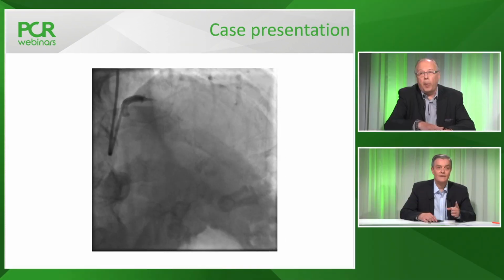Yeah, it's actually a question coming from the audience whether angulation of the side branch decides choice of culotte into true bifurcation with a planned two-stent strategy. So how relevant is narrow versus wide angle in selecting which culotte you will select, inverted or provisional? I think, again, it's a question of access.